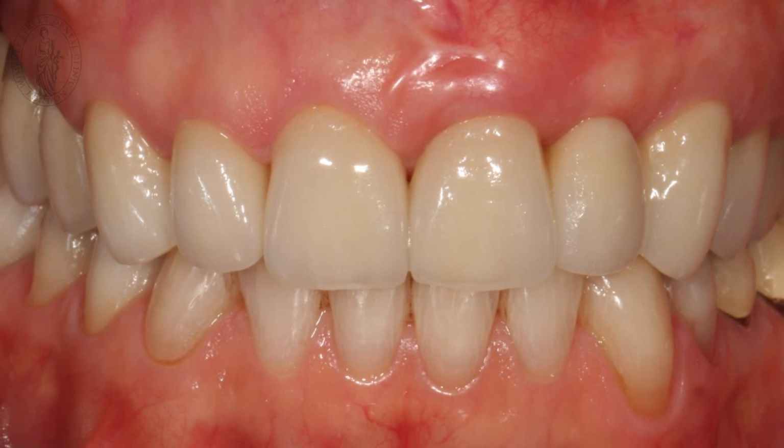The central incisor on the right side has still a little bit more gums, but that's okay because we've done a so-called connective tissue graft. That means a graft from the palate here, and the gums here will recede within the next 1 to 2 years by approximately 0.5 millimeter, maximum 1 millimeter. So you can see perfect work with regards to ceramic, good margins, and on the right side, the left lateral incisor is adjusted well to the gums as well, and this will stay as it is.